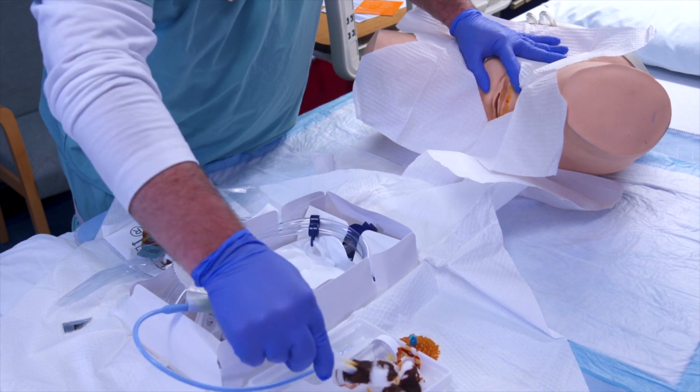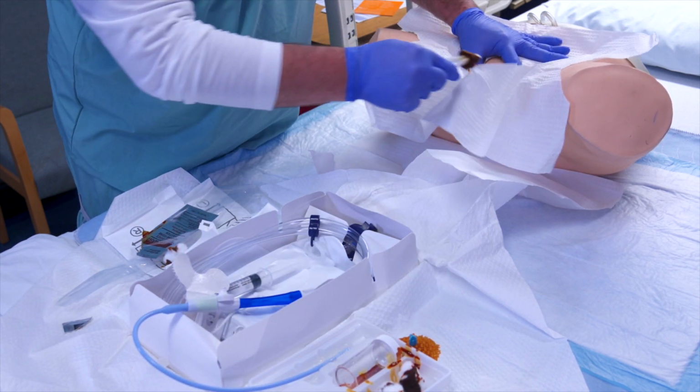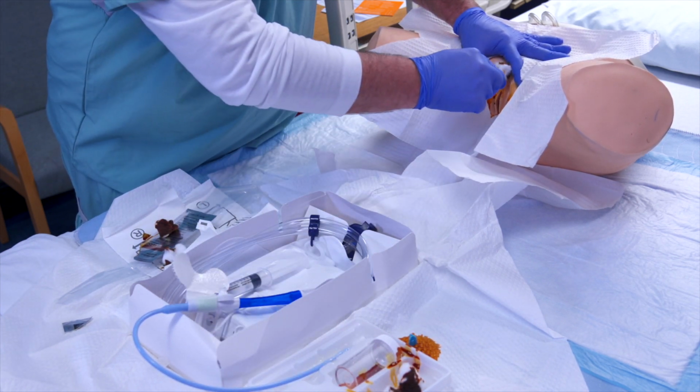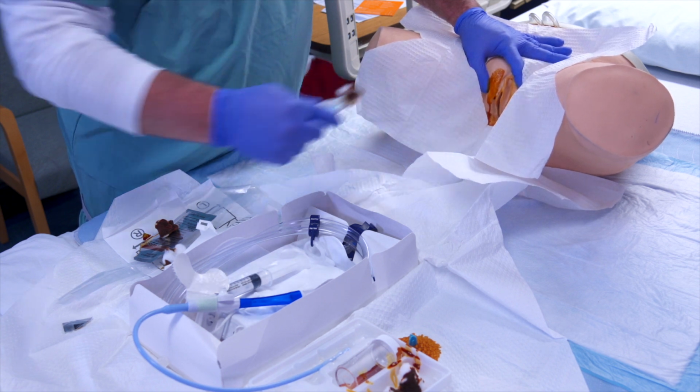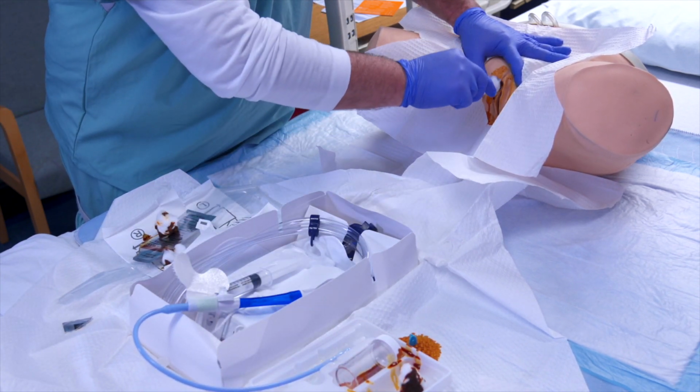sterile dominant hand. With the second cotton ball, wipe the other side of the labia minora, again with a downward stroke. With the third cotton ball, wipe the center of the meatus with a downward stroke. Repeat wiping until all cotton balls are used.